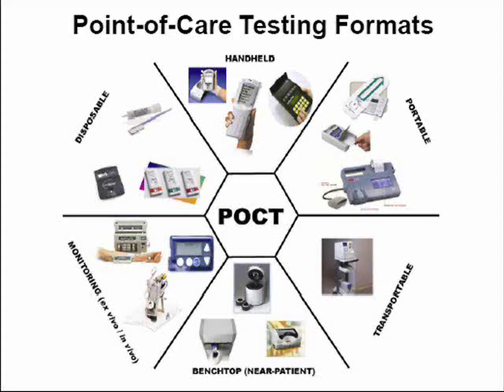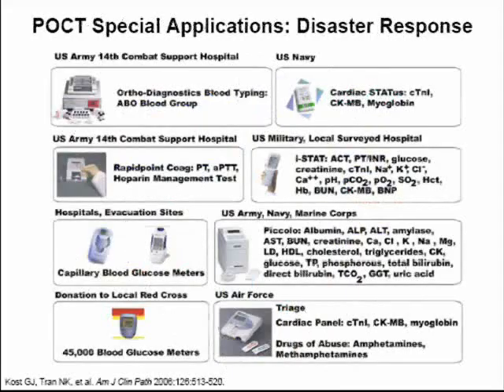These are immunoassay based and they are qualitative in nature. They again look for the same types of cardiac biomarkers, including cardiac troponin I, myoglobin, and CKMB. And at the top, we have a very interesting disposable device, which is an HIV 1 and 2 test, which is based off of oral swabs, which is rather easy to use. Of course, these devices, which appear to be for hospital use only, are not limited to the hospital environment.